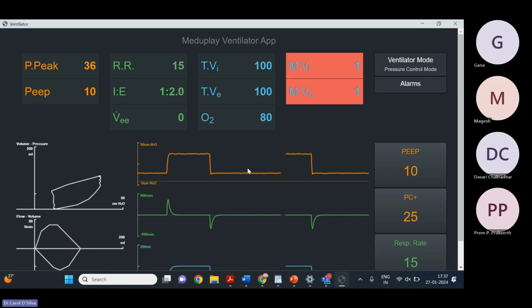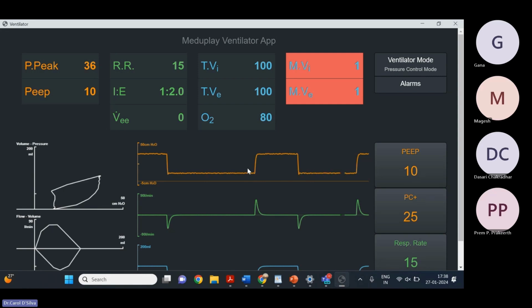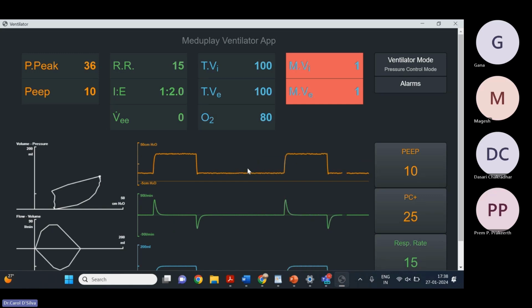It will do it. If you, for an experiment, take a test lung, put a patient from volume control to PRVC mode, what it will first give on PRVC is a volume control breath, and then it will switch to a pressure control mode. Why it does that is first it will give you a volume control breath. It will measure the compliance and resistance from the peak pressures. And then for the least amount of pressure that is required to achieve the tidal volume, it will set it. So it will calculate this pressure control minus P.